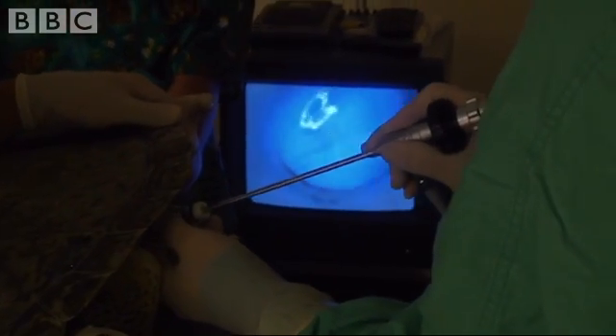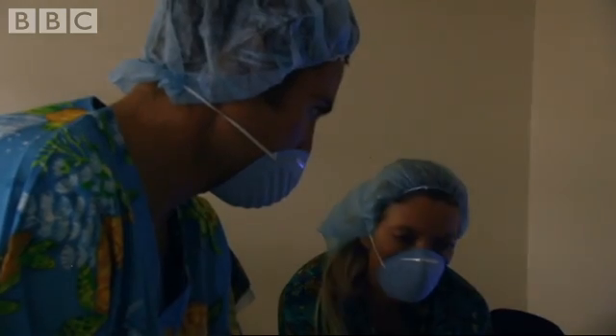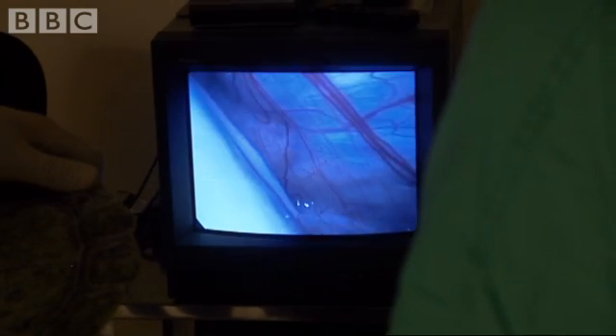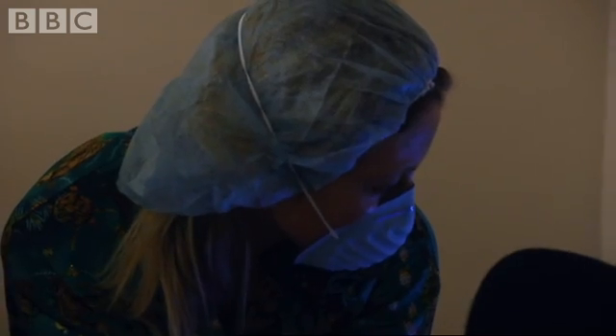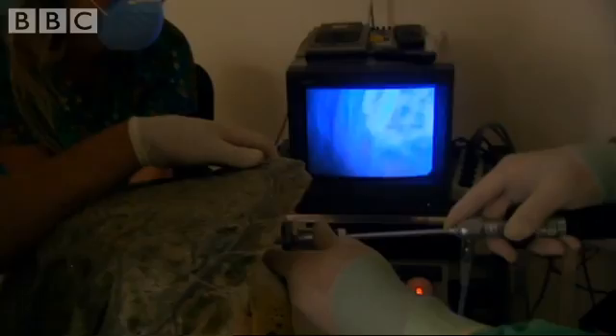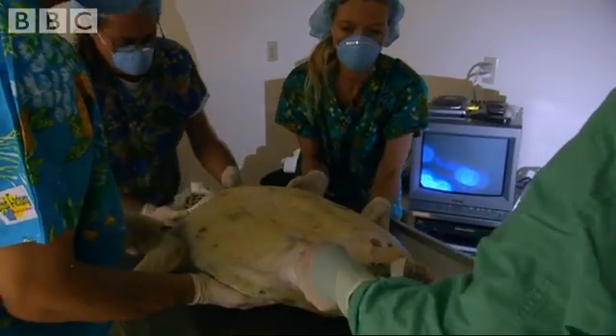Hopefully, we'll find no tumours. There's her intestines. There's the back of the lung right there — that's the area where the tumour would be. And there's no tumour. That's brilliant. Those are all eggs — those are hopefully little baby turtles that will be out there for our grandkids. Now we're going to roll her back over, disconnect her. It's good news — we can now use surgery to remove the external tumours.